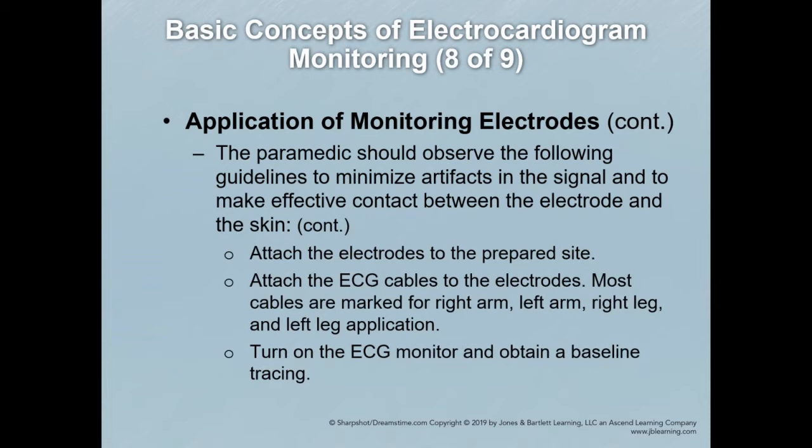You'll put those electrodes on that prepared site. Okay, like I said, remember in hospital you'll see a lot of the insides of the wrists, the insides of the ankles for the limb leads. In the pre-hospital setting, you'll see a lot of torso attachment.